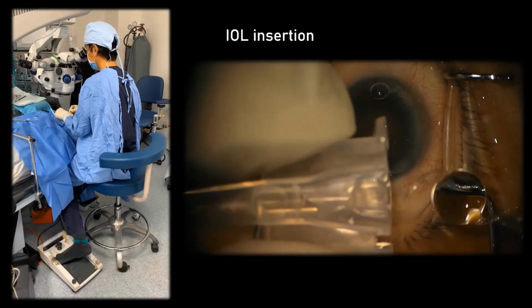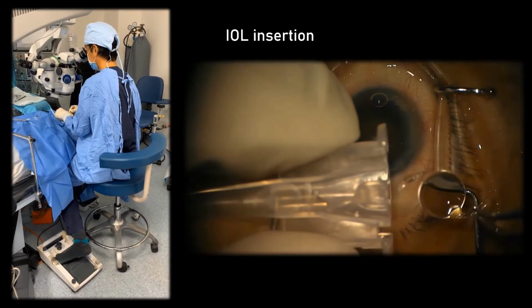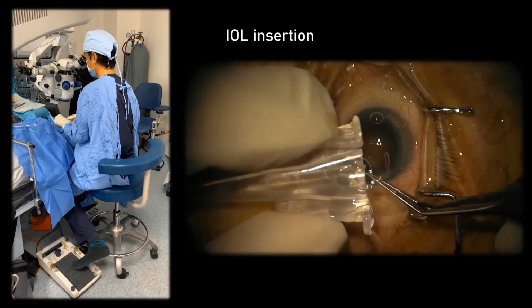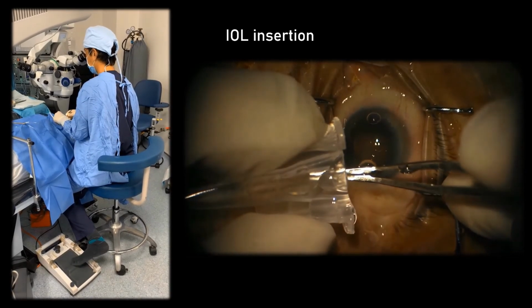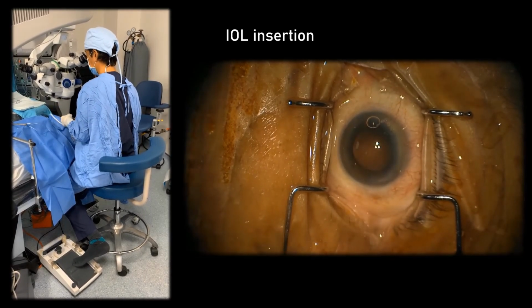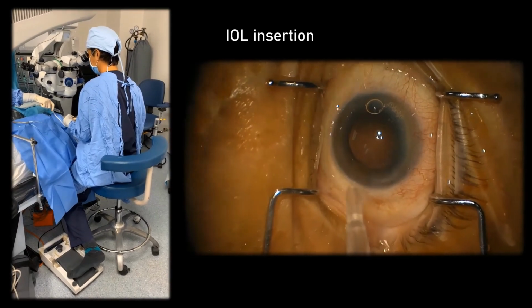With the exception of the left foot pedal control, the rest of the operation through the temporal section is done just in the usual fashion as in any other superior section. Here I try to demonstrate the changing of the zoom and focus during the IOL insertion to the eye.